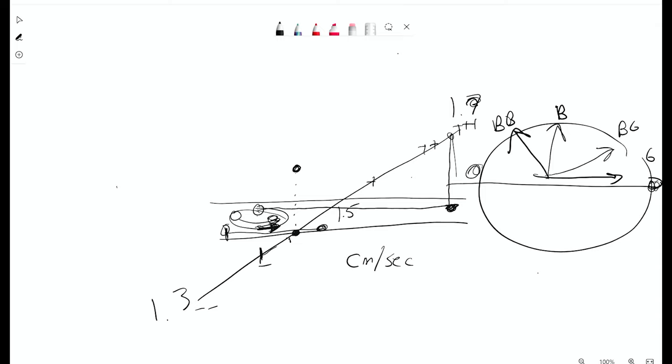But what we have to do is determine what this 180 is. And that's called the Venc, velocity encoding. The Venc is going to be how steep this gradient is going to be applied.